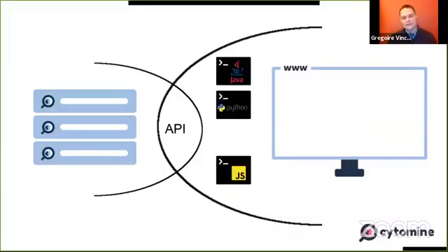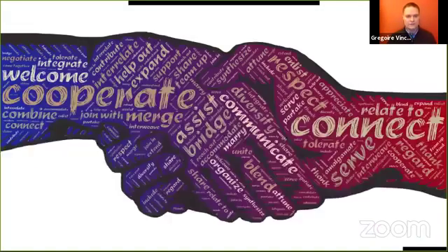And for that at Cytomine, we also pay attention to having an API to build a technical bridge between the two worlds, the world of the pathologist with the screen and the world of the data scientist with the access to the storage and the computer centers. That's why we use APIs built in Java, Python, and open standards and open formats and so on, to be sure that we can get interconnected with the data of the scientist.